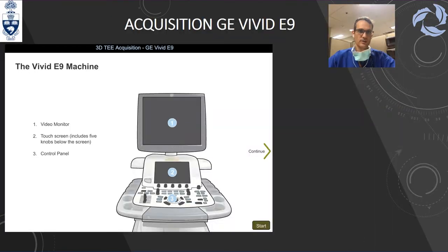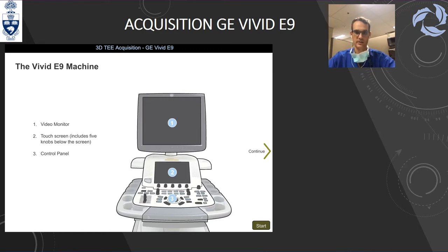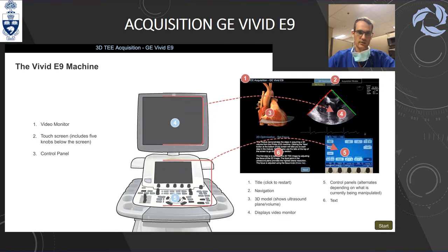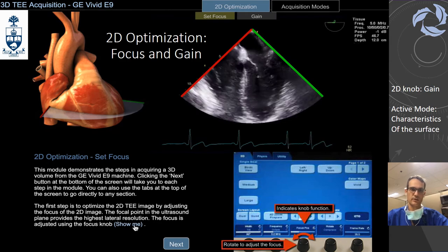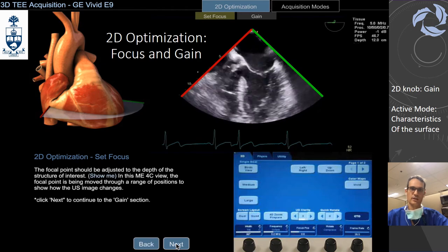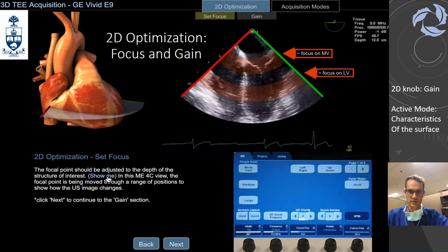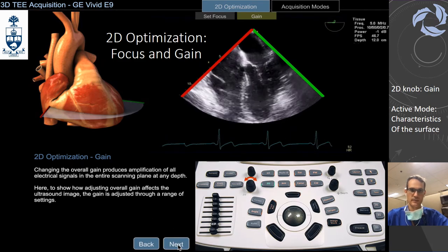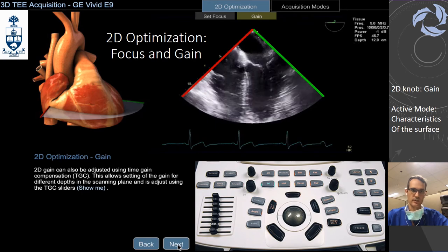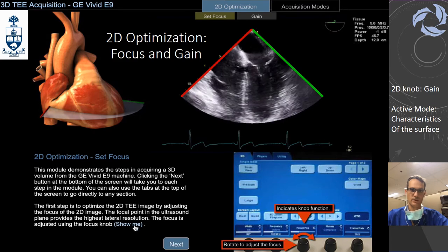That was the introduction for the Philips Epic Q7. Now we are going to talk about how to manage the GE Vivid E9. It's not the latest model but it's the one we have as backup. The console has a video monitor, a tactile screen, and knobs and panel control. The first thing, exactly the same as Philips: optimize your focus and optimize your gain. Here is where you find the focus — focus on the mitral, on the LV, on the tricuspid, wherever you want to go. For gain, use the 2D knob and rotate to the right or left.